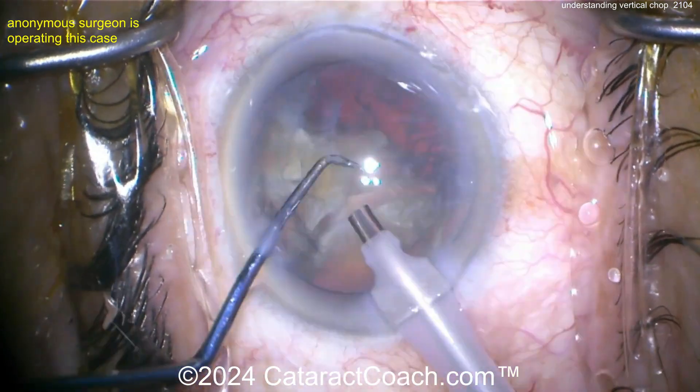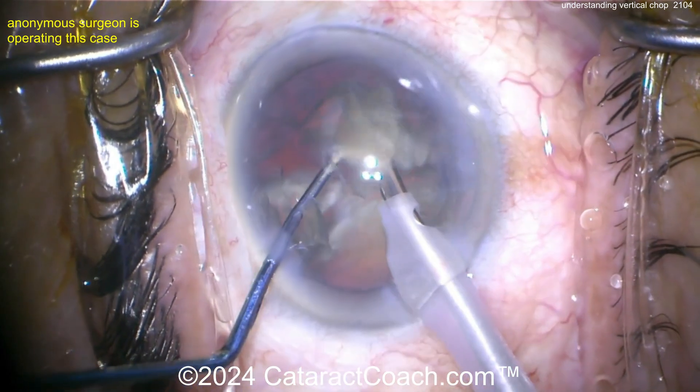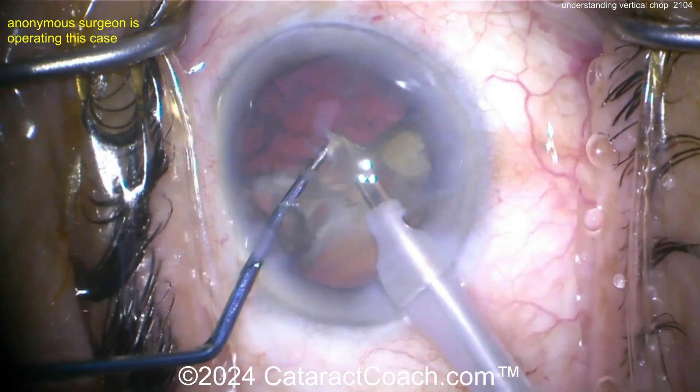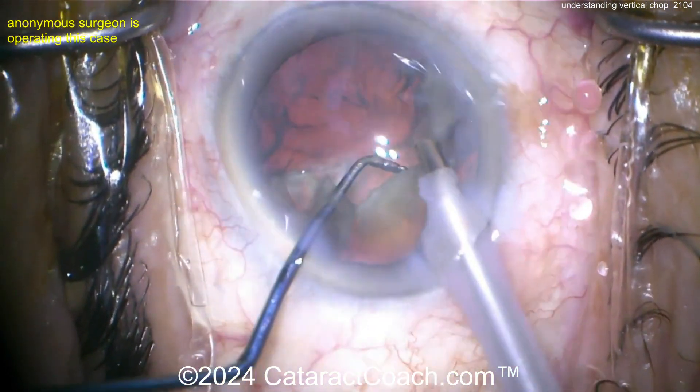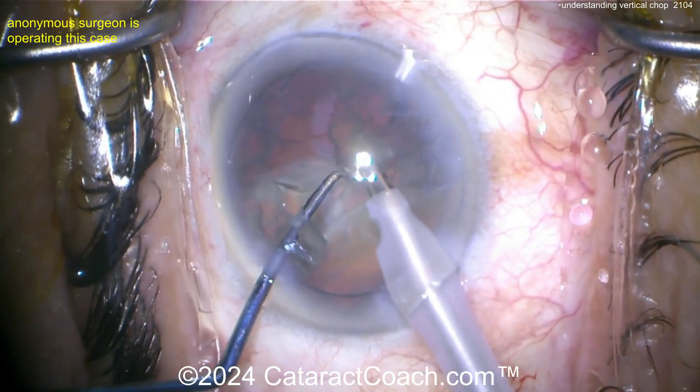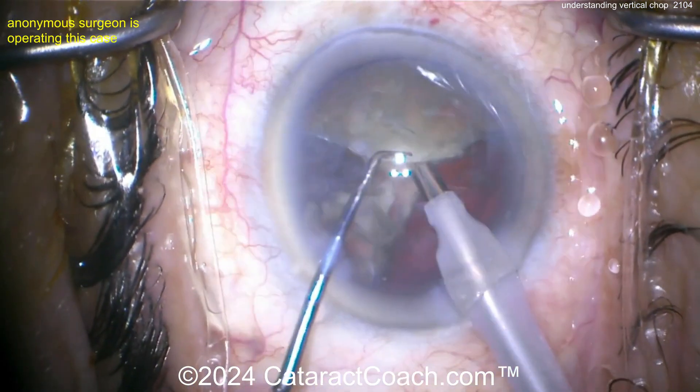You need a chopper with a relatively sharp tip — a dull or ball-tip chopper won't embed and pierce into the nucleus. You also need high vacuum holding power with the phaco probe, because that's what holds the nucleus still as you dig the chopper into it.